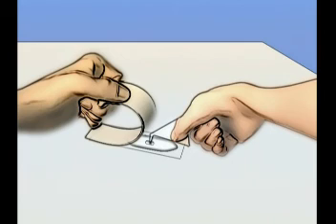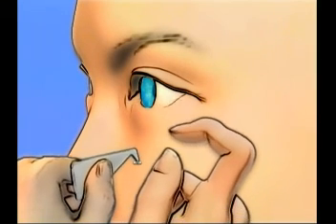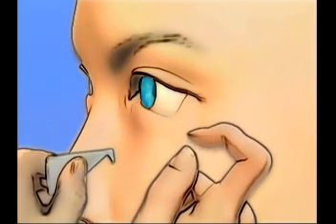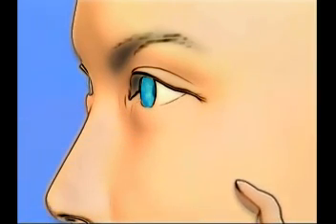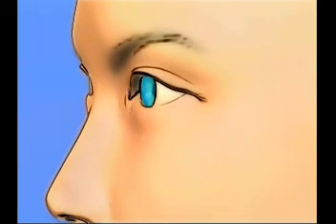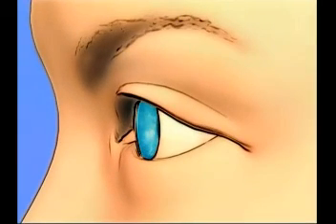Pick up your dose of Lacrisert with the applicator, then gently grasp open your lower eyelid and place the dose deep in the pocket called the lower cul-de-sac. Once you insert the Lacrisert to the inside of your eyelid, it should come off the applicator. Let your eyelid close as usual. You may or may not feel what is called a foreign body sensation when you start using Lacrisert. That's the feeling you have something in your eye. If placed properly, it should not be uncomfortable.